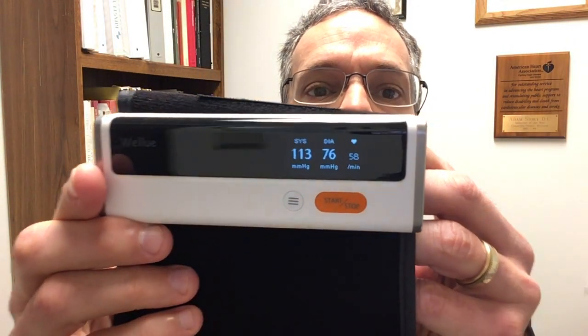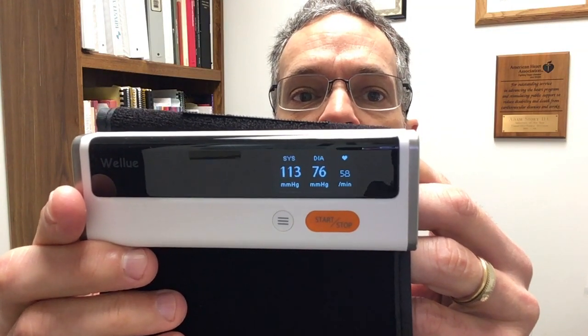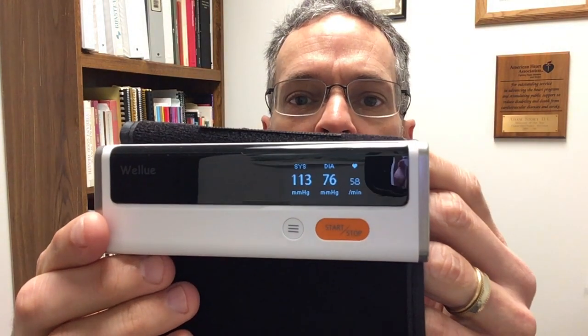You're going to put this on the inside part of your arm and tighten it so it's snug but not too tight — that's essentially how it's done. Then prop your arm up. Make sure you do not talk when you take your blood pressure. You simply hit start or stop — it's that easy. My blood pressure was 113 over 76 with a 58 pulse.